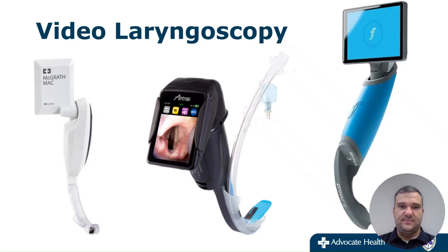Just a few examples here. We have the McGrath, we have the AirTrax, and then we have the ProView, which is a little bit newer of a device. For the videos that we're going to be showing in regards to intubation, we'll be using the AirTrax device, which was loaned to us for this demonstration. But again, whatever device you guys are carrying on your rigs is appropriate at this time.